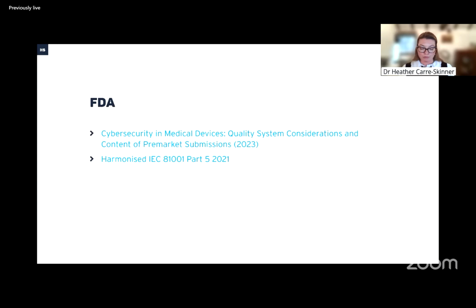Yeah, so we'll touch very quickly on our friends over the pond in the US. With the FDA, they've always, I would say, been a little bit one step ahead of the curve in terms of cybersecurity. Their main guidance, the final one, was released in 2023, which is cybersecurity in medical devices, quality system considerations, and content of pre-market submissions. It does exactly what you think it is.